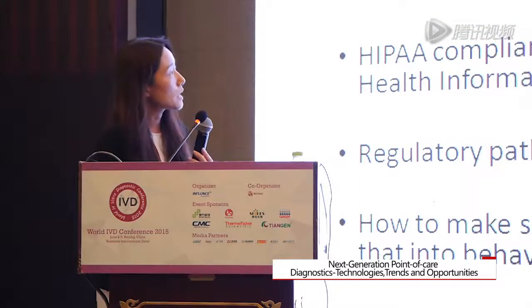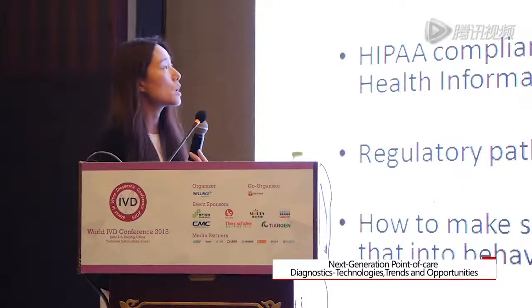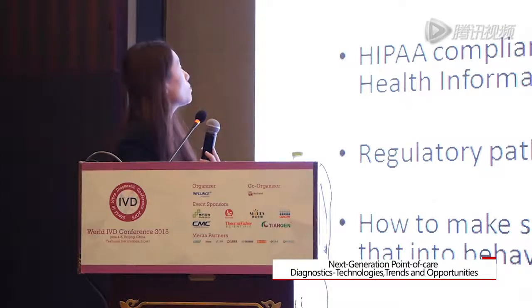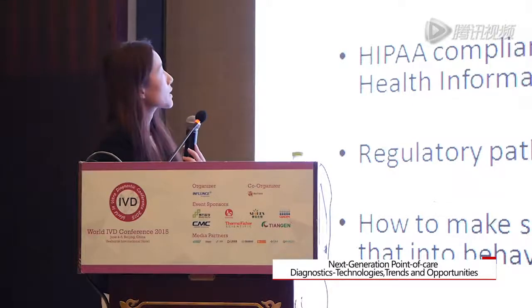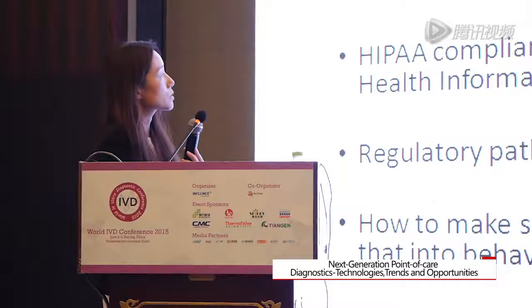So what are the challenges? At the same time, we really view these challenges as opportunities, because they give you some chance to address and meet them. The first challenge I see for the next generation point of care is how do we ensure the quality of results? How do we make sure the results are accurate, and how do we make sure they are reproducible? In our clinical chemistry jargon, how do we ensure that the precision and accuracy is good? And then how do we assure the data transmission is HIPAA compliant? As I mentioned before, we actually have solutions to address that, so this has been taken care of.